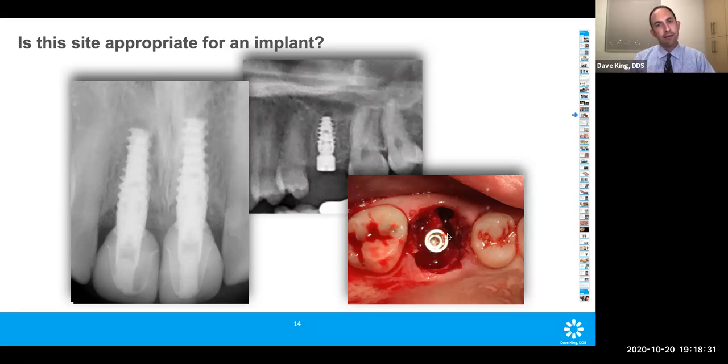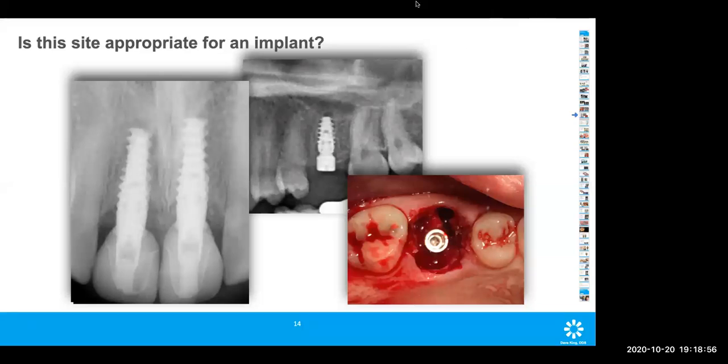So we had picked that implant site based on where the bone mass was in between the tooth roots, if that makes any sense. So I felt like it'd be easier to go ahead and do the osteotomy through the roots and then take the roots out than doing it the other way around. Ultimately, could I have done it the other way in this case? Yes, he had tons of interradicular bone, and so it would have been just fine. Did that answer the question there? I think so, and I think the next question is very similar. Why did you decide to do the pilot hole before taking roots out instead of taking the whole tooth out first? So yeah, it's just about stability.